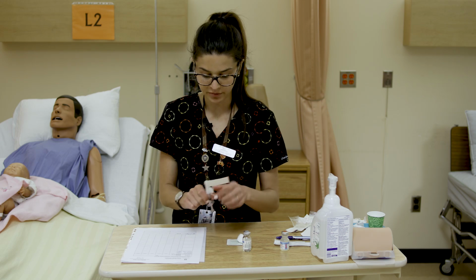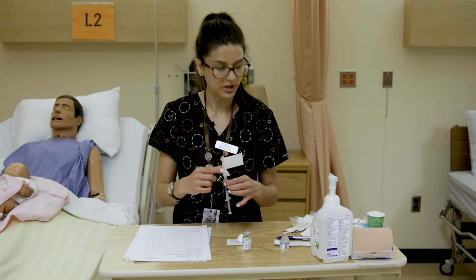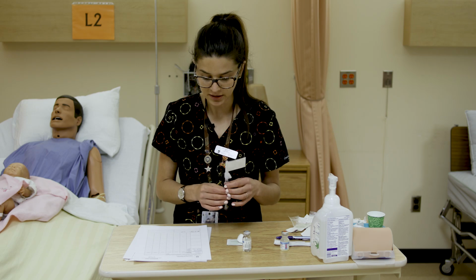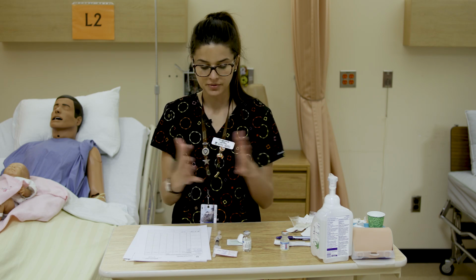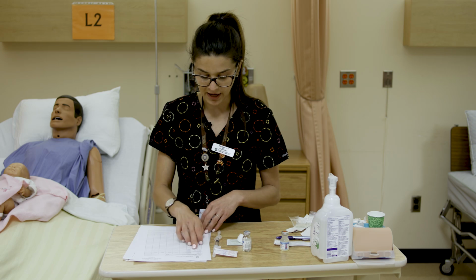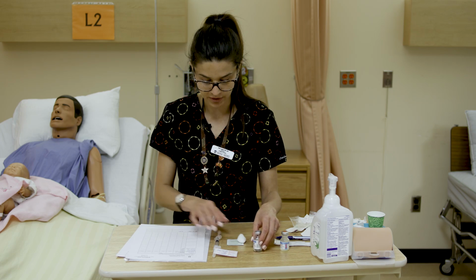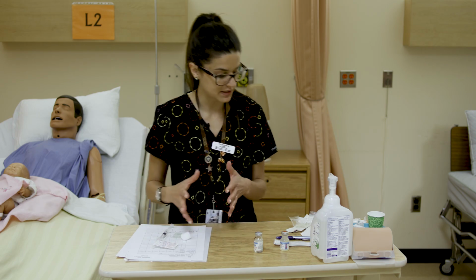So we have reviewed the chart for our facility, and we know that a 23 gauge 1-inch needle is appropriate for our patient in this setting. And then the correct time: it's every 6 hours, so you just want to make sure you're on one of those time frames, it hasn't already been given, and it's within the 7 days that it was ordered for. So we've done our second check, and we can grab a pair of gloves and proceed to the bedside.